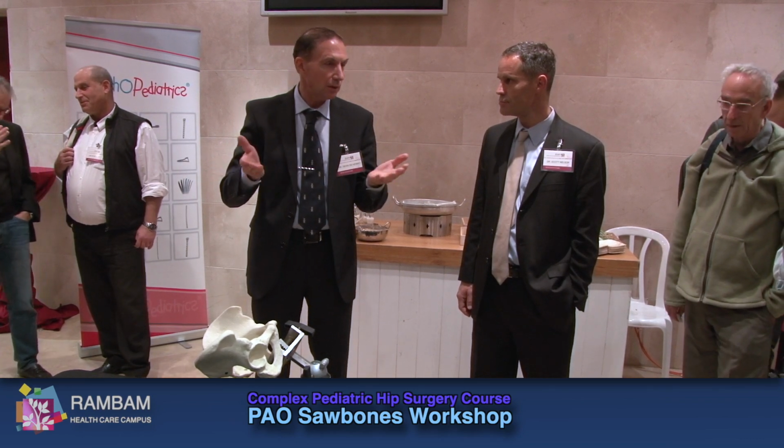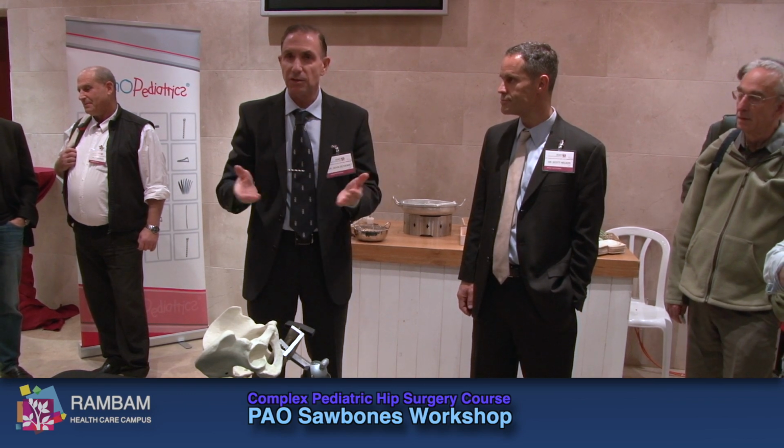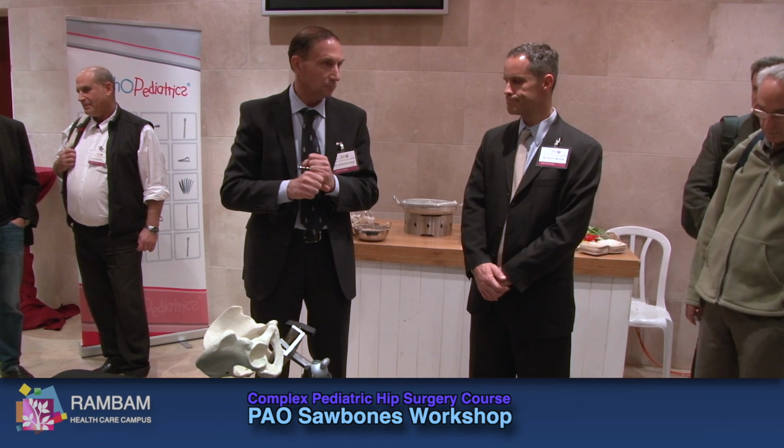Somebody asked Professor Ganz while he was doing a live surgery, how big an incision? It depends on how big the patient is. The bigger the patient, the bigger the incision. You need to see. You need to be comfortable doing the osteotomy. The ultimate end point of your approach is to do a perfect osteotomy.